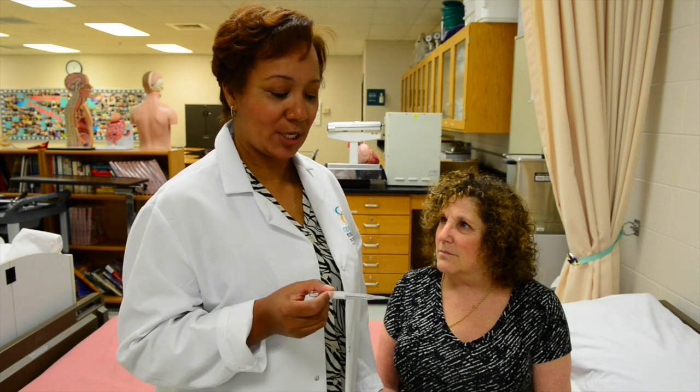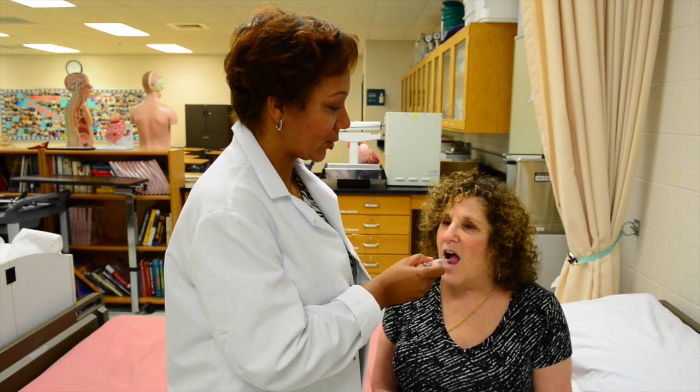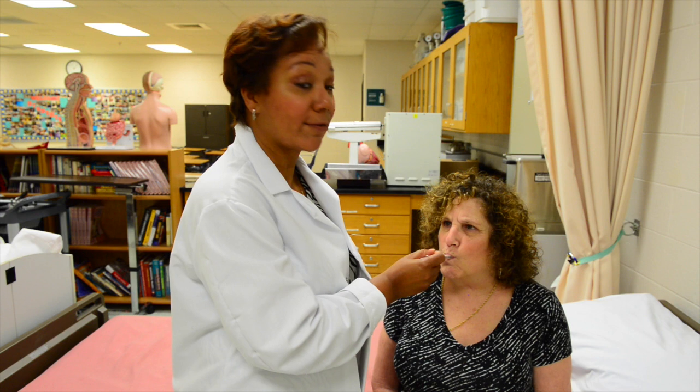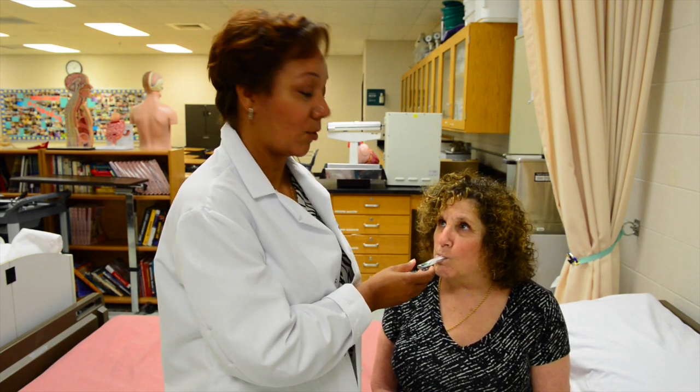Once the sheath is placed on the thermometer to protect the patient as well as the equipment, you will place the thermometer under the patient's tongue for three to five minutes. Please remind them that they should not bite down on the thermometer.